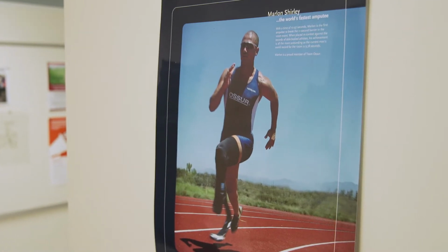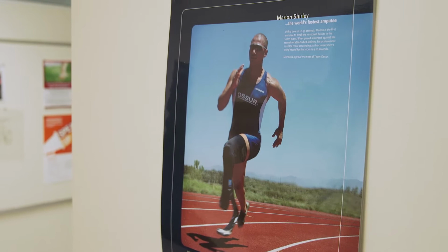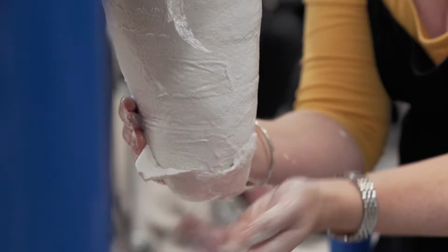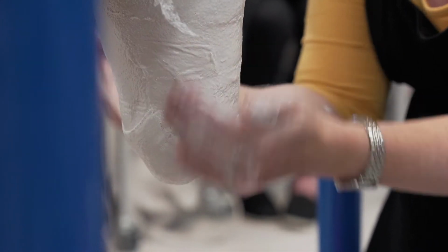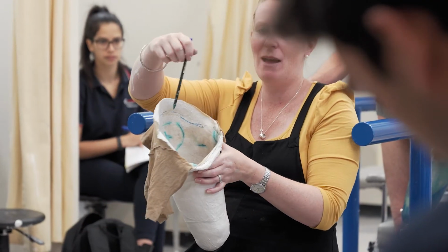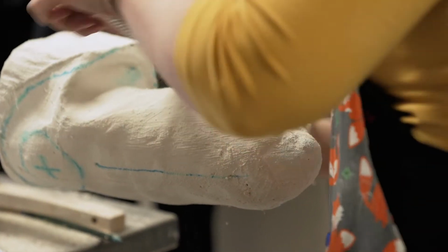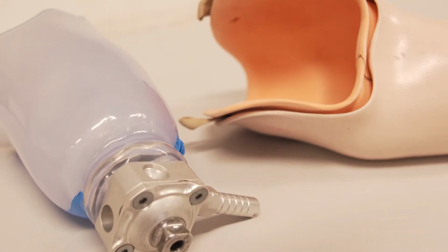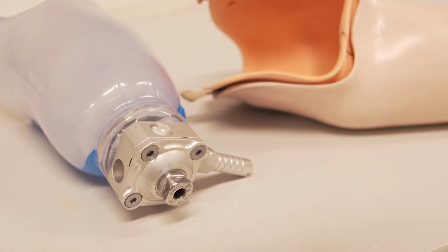It's very goals focused, so it's what the client wishes to be able to get out of the prostheses, and that can be anywhere from just being able to sit comfortably in a wheelchair to being able to go and play sports in the community. We'll take a few measurements of their residual limb, and then we'll start the process of casting. And then taking that cast, filling it, doing some modifications, almost like, in simple terms, sculptural work. And we'll then end up making a hard socket, then constructing the limb from that.